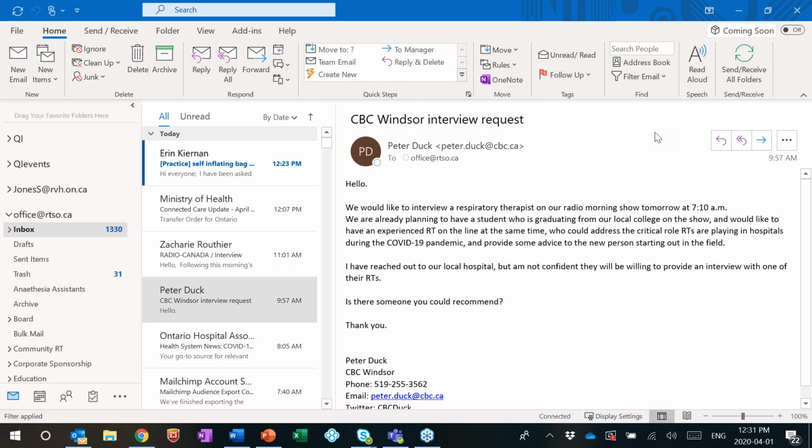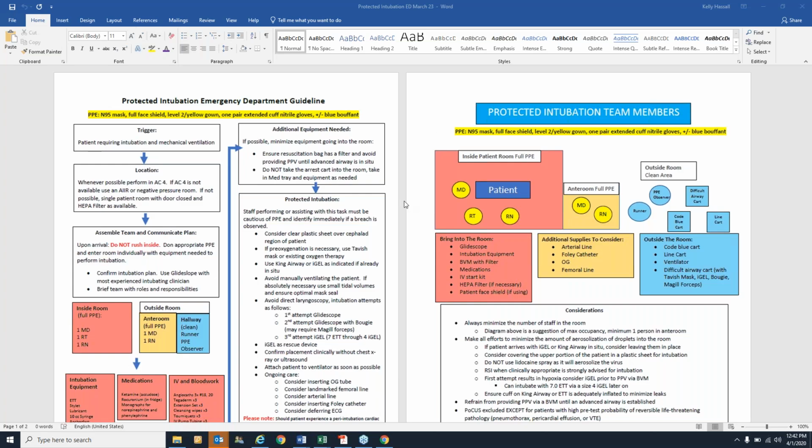It also allows the person who's intubating a fair bit of distance. I don't want to plug any company, but we do use the GlideScope platform, and it allows the intubator to have their face a fair bit away from the actual face of the patient. Some things that we observed, for ETT confirmation, again, you have direct visualization.